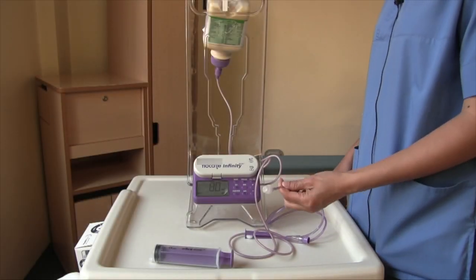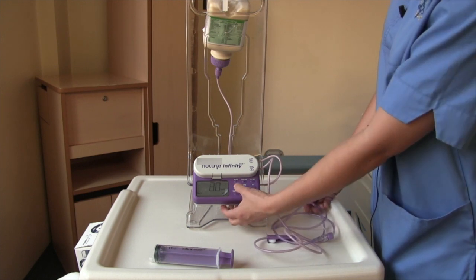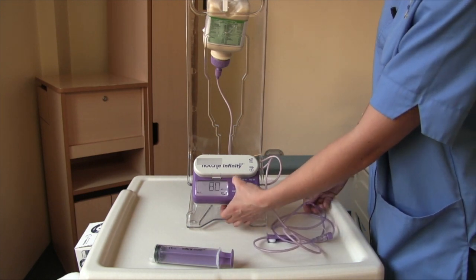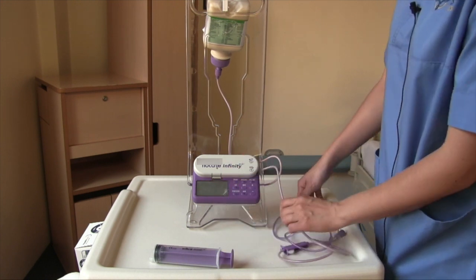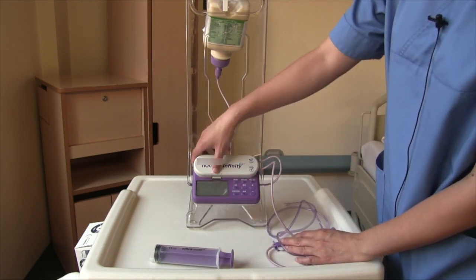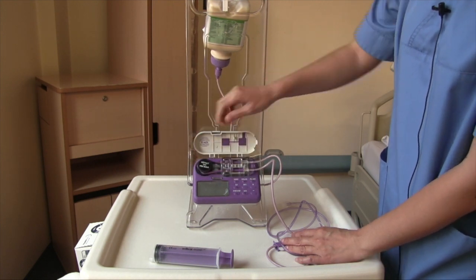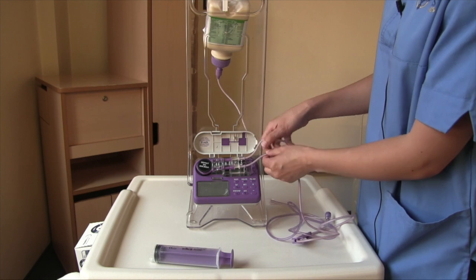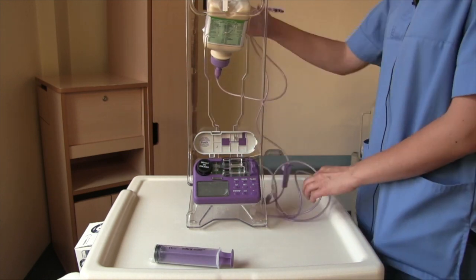Once you've disconnected the feeding set from your tube, you can turn off the machine by pressing the on-off button and holding it until you hear a beep, then the screen will go blank. Again, to open the door, you simply put your finger in between those two lines, press in and lift. And you can take the feeding set out by simply lifting the tubing and lifting off.